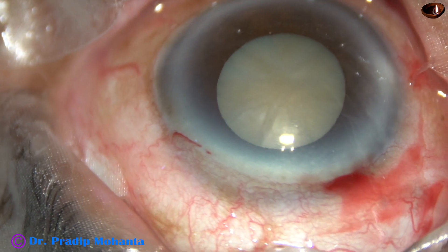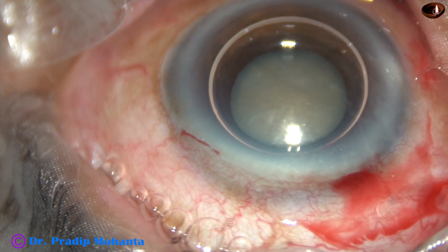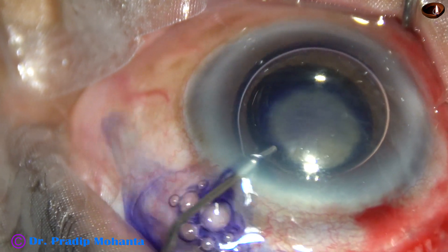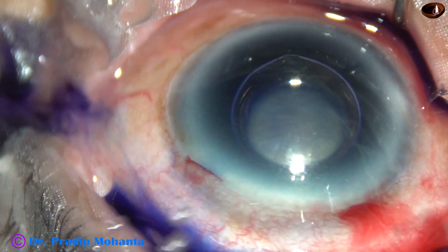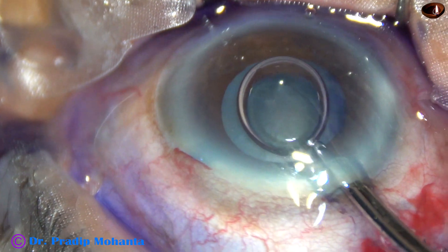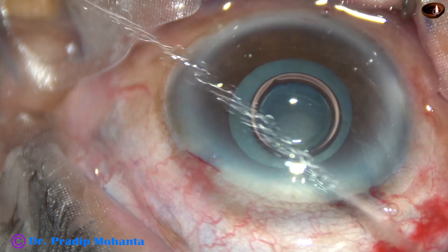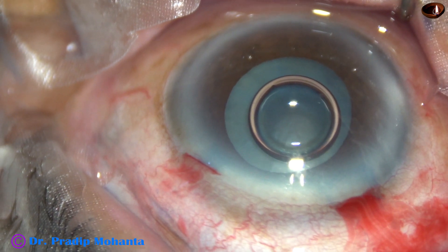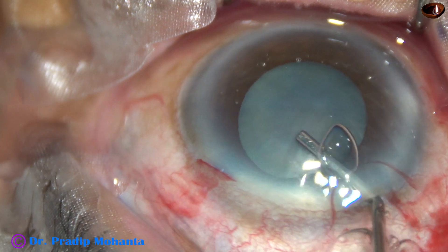By this time, the main incision has been made. A side port on the left side of the main incision has been placed. And now the anterior capsule is being stained underneath an air bubble. Whenever I apply an air bubble, I find that the staining is almost immediate, and the dye can be washed out immediately after applying it, after 5-6 seconds. And now I use a viscoelastic substance — this is 2% HPMC, that is hydroxypropylmethylcellulose.